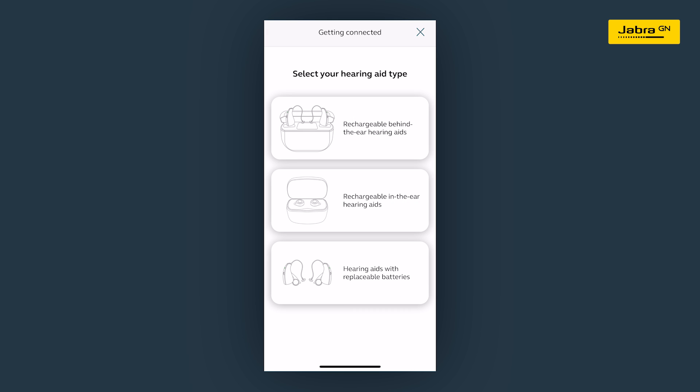The app will ask you to select your type of hearing aids from the list on the screen. Tap on the picture of the hearing aids you'd like to connect.